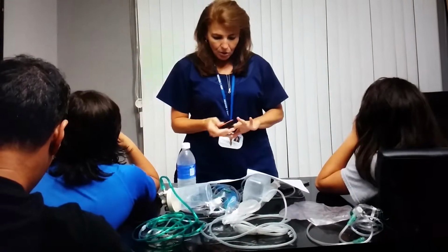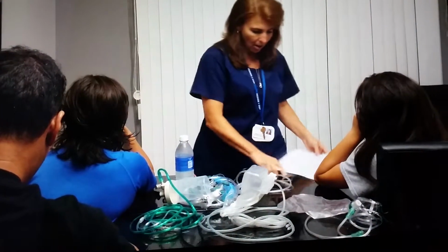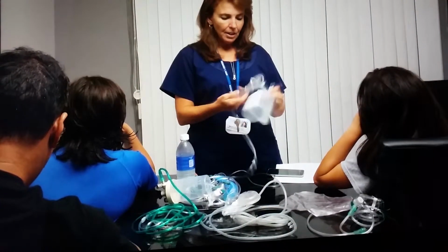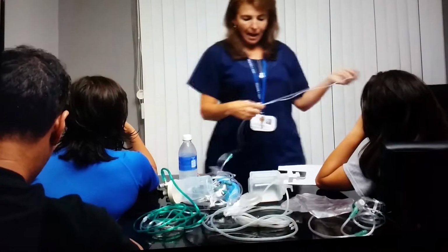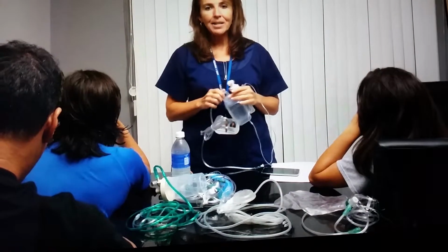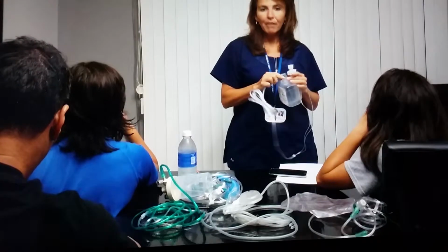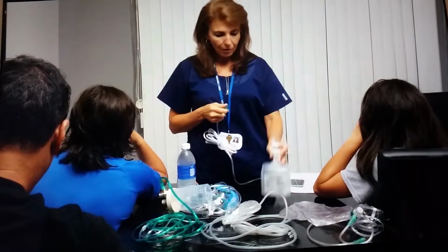So moving on to oxygen therapy, we're going to look at some basic oxygen equipment. We'll start out first with your nasal cannula. Nasal cannula flows 1 to 6 liters. After 4 liters, we would want to humidify the oxygen. It can be very dry. If the patient has bleeding or dry nares, or any patient complaints, we can humidify at any level, but our policy does state after 4 liters we would humidify.